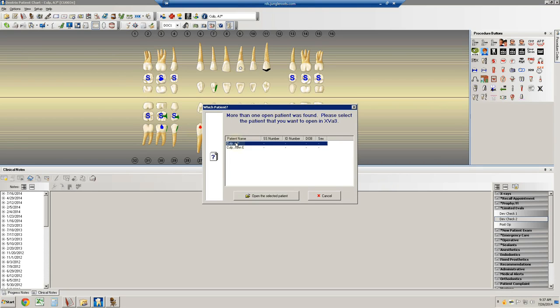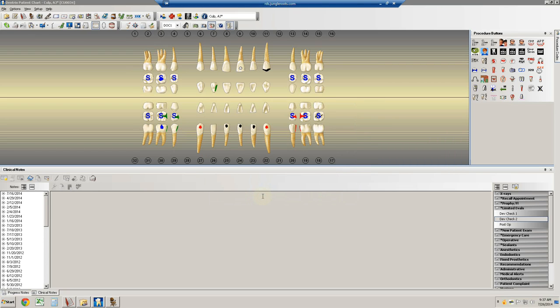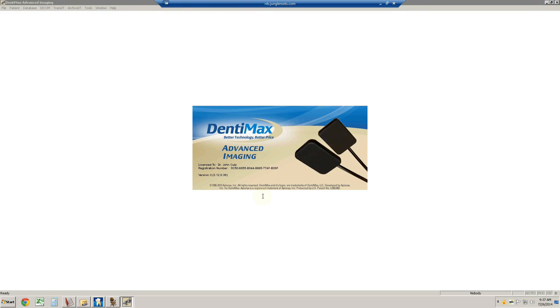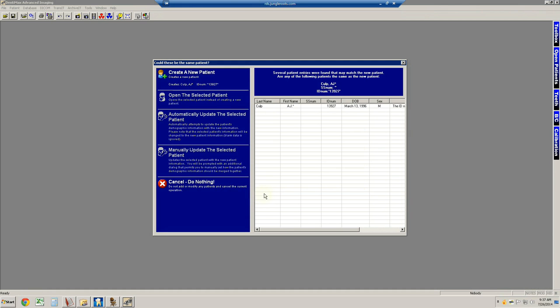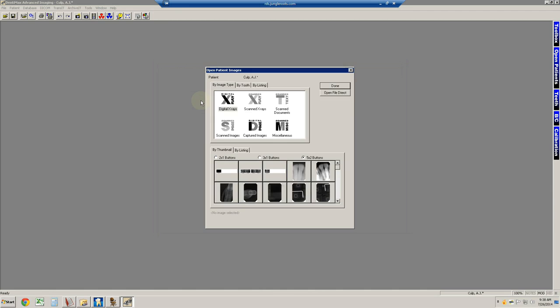If there's some possible confusion that the computer has based upon the person you're trying to select, it might ask you specifically, so you might have to verify via a birthday. But when you have the right person, you hit Open Patients, and the software will come up and demonstrate all X-rays. It's asking again. That happens sometimes. Selecting AJ Culp, and then open the Selected Patient, and this is the screen.